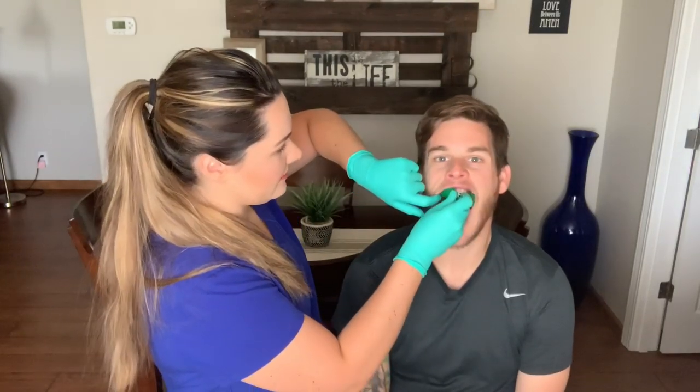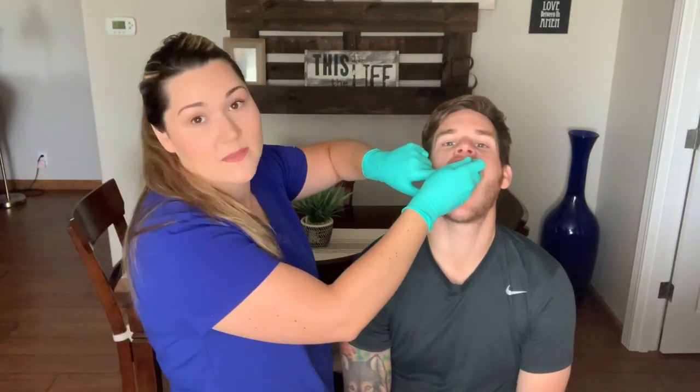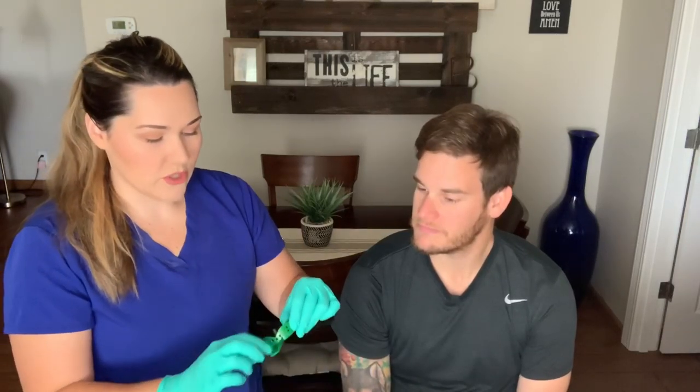The large one fits him well. The way you want to check: make sure their wisdom tooth or the very back molar fits into the tray, and make sure it's not too tight on the teeth because if it's too tight you're going to go through the impression material and have divots on the tray. I'll show you what the medium looks like — you can see his wisdom teeth are sticking out the back and his teeth come really close up to the front, leaving no room for impression material between the teeth and the tray.